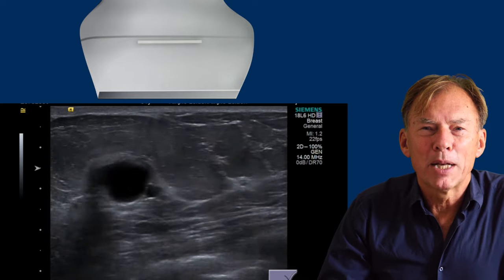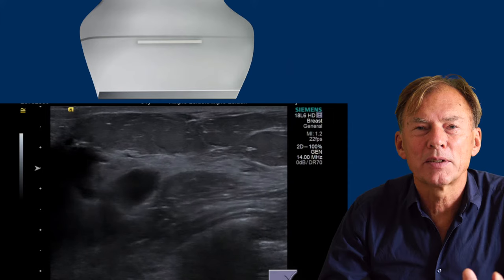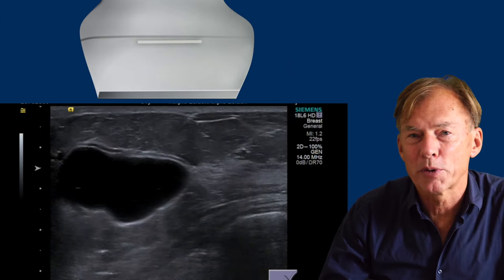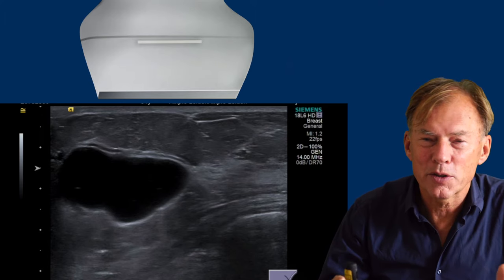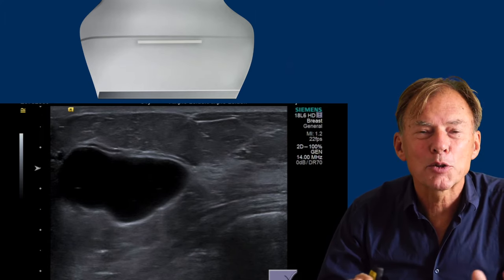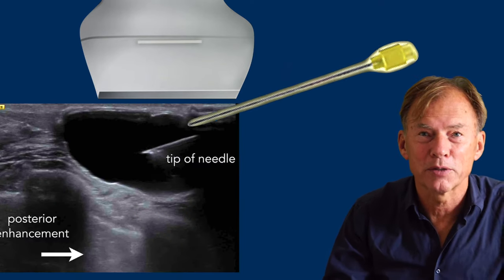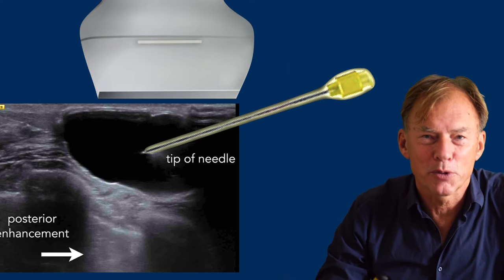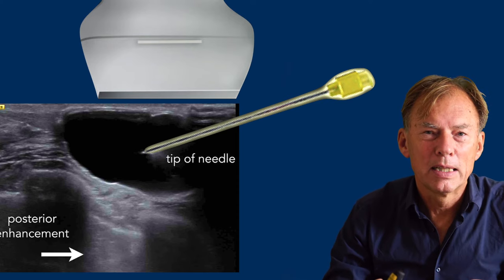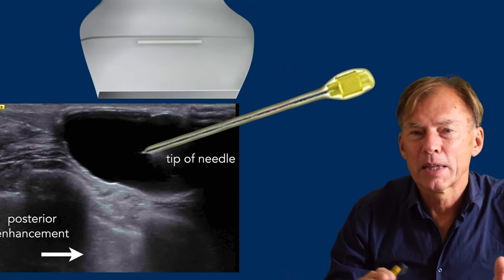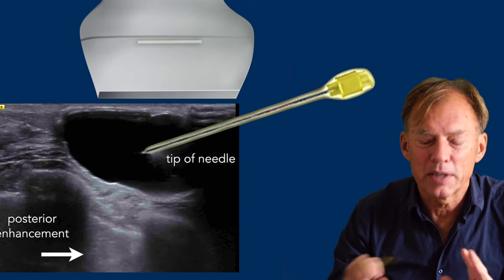Here is a video of a palpable cyst. The cyst was painful and it was decided to do a puncture with aspiration of the fluid. Notice that the wall is a little bit thickened — frequently a sign of low-grade infection and explains why the cyst was painful. Uncomplicated cysts are usually not painful. Aspiration is a quick and simple procedure. In most cases the fluid has a transparent yellow color, but it can be green or brown — it doesn't matter. Examination of the aspirated fluid is not necessary.